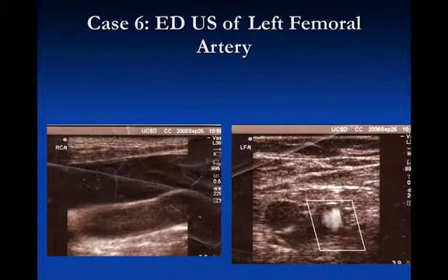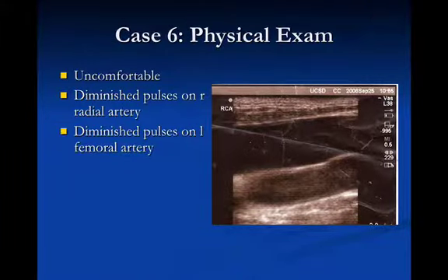So then the next thing I did is I got a couple stills, and it almost looked like there was clot in everything. At the right carotid artery, it looked like it was all clotted off up top. You can see the vein above it, and then the carotid artery, and the carotid artery just looked filled with sludge, basically. The left femoral artery occasionally looked like it had flow, but the leg was cold. Again, this is the right carotid artery.